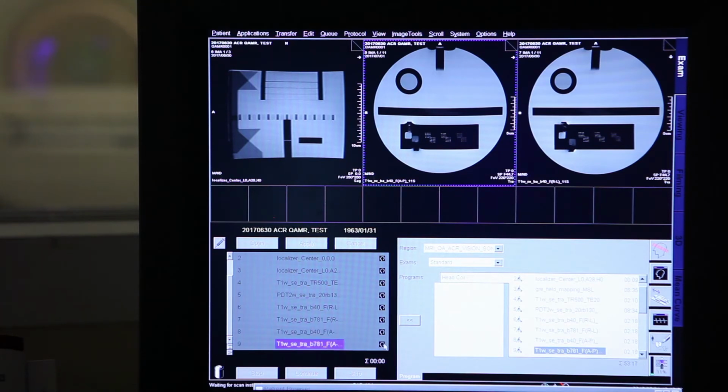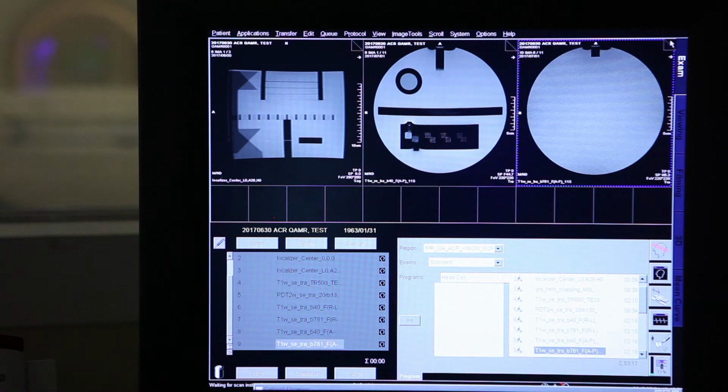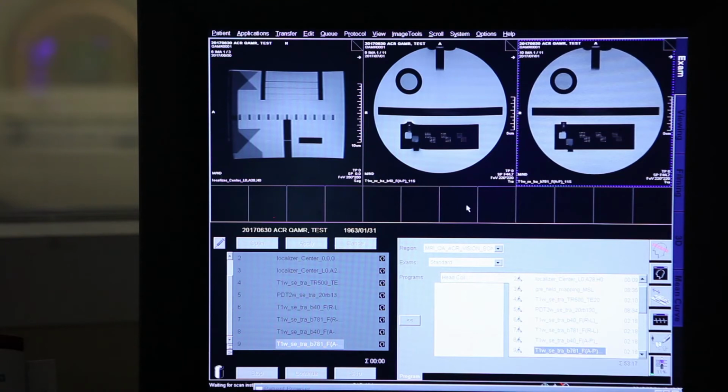We're going to put it again there. Let's see fat and water. There should be noise there, but here it's still the same. And as you can see, you have a correction of the gradient itself. You don't have geometric problems. That's the other issue with higher bandwidths.